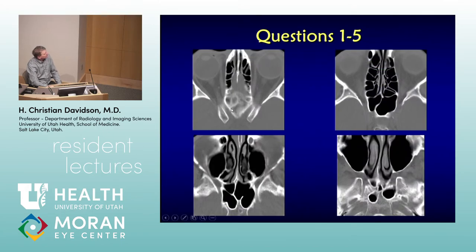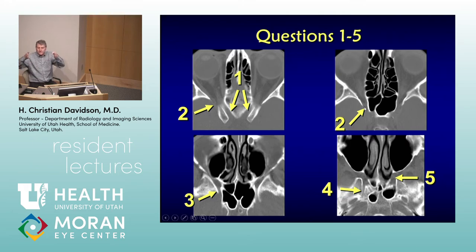So if in the right slice, you can't see the chiasm forming because the optic canal really is coming at a pretty steep angle. So the optic canals do come in angled toward each other like this. And a rookie mistake is to see this and think it's the optic canal. But one thing to remember is the fissure looks like it's a little short thing. It's coming straight back, whereas the optic canals are coming at an angle toward each other to make the chiasm.